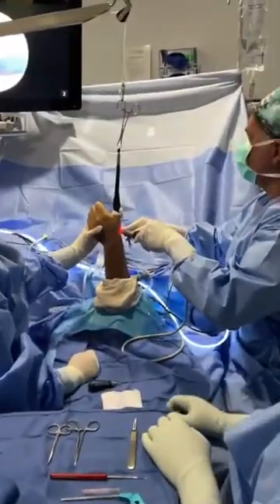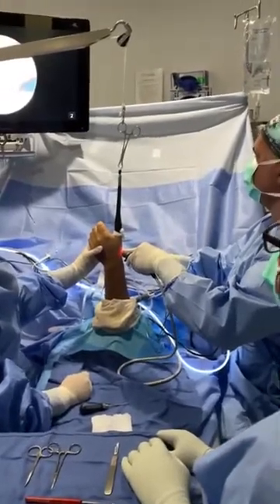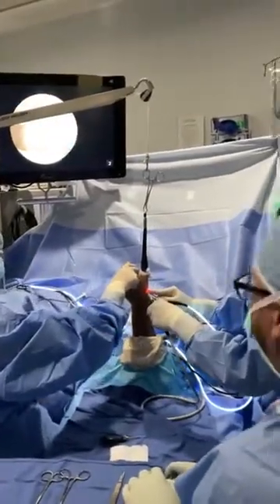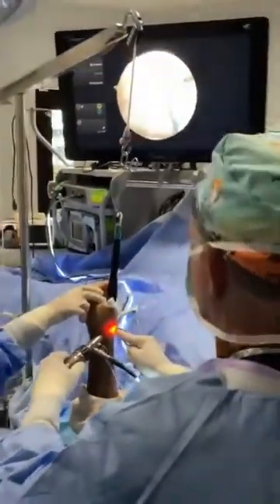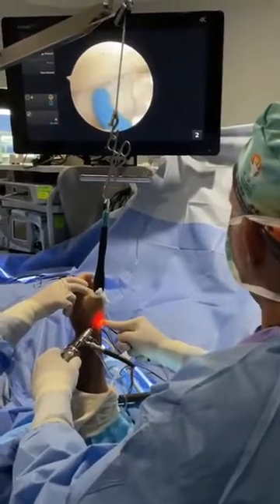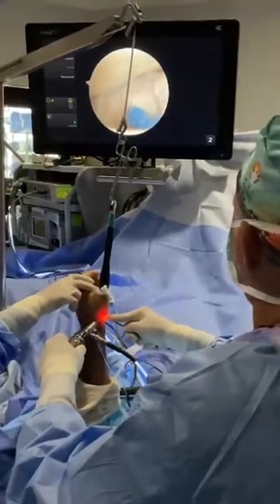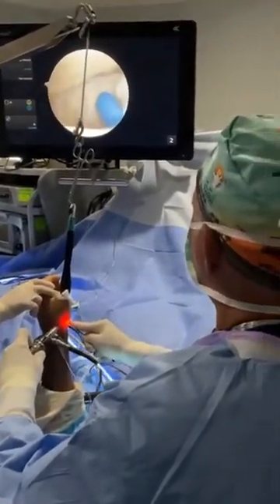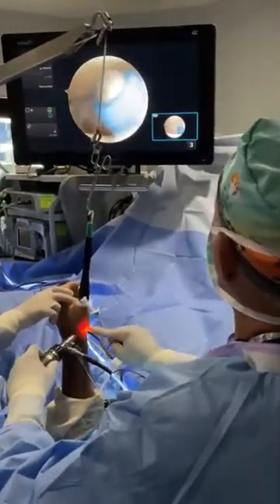You don't want to be too aggressive with this. You can see I'm just touching the tissue. Now I'm going to do another stripe — I call this a striping technique, which I've described in papers I've written. The reason being is you want to make sure that in between the stripes, this area has good blood supply for healing. You don't want to paint the whole capsule. See how it looks better — tighter.